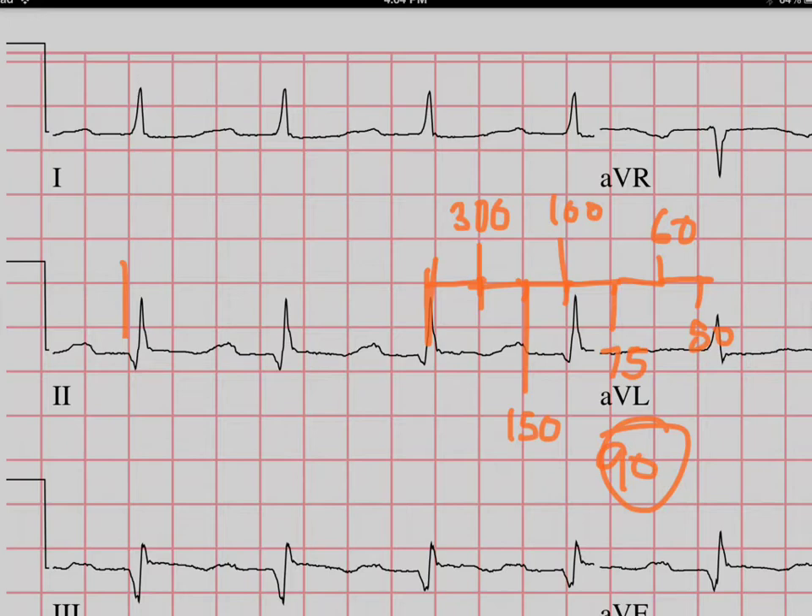Honestly, the way I look at the rate is I just look at what the machine calculates, because it's going to do a much better job than I do. However, there are some times when the machine is wrong, so it's good to know how to do it this way too. So that's how you calculate rate.